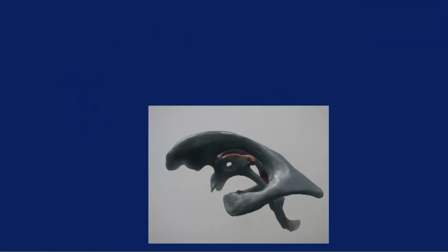So let's review the ventricular anatomy from the endoscopic standpoint. I think that's really important. Even though we're doing an ETV and you'll go from the frontal horn through the foramen into the anterior third ventricle and through the floor, in a larger sense, it's helpful to review some of the more basic aspects of the anatomy.